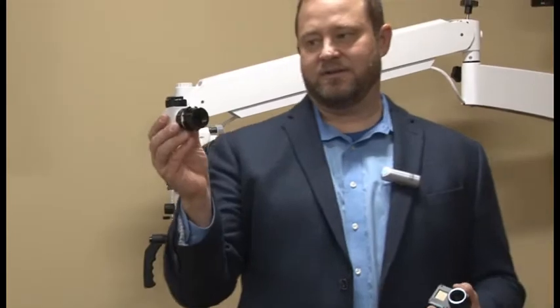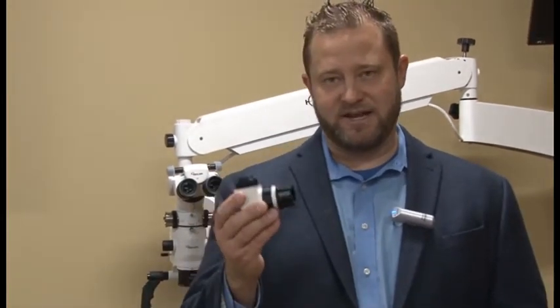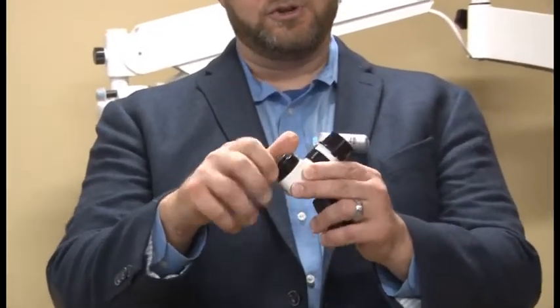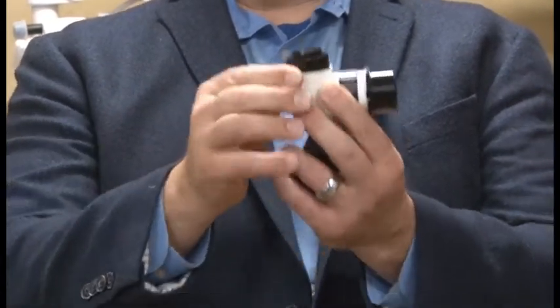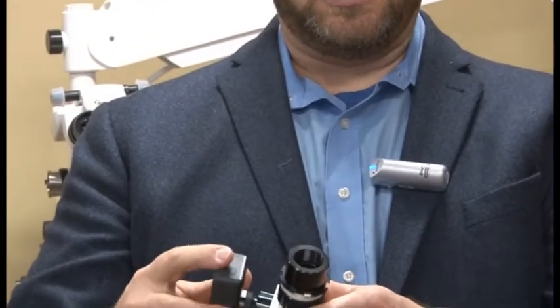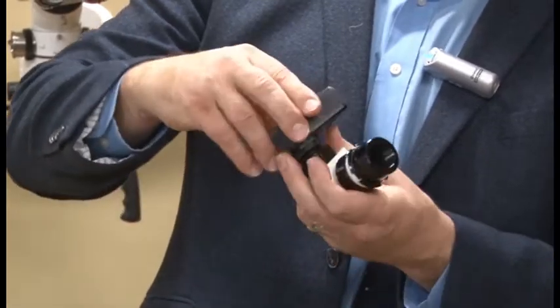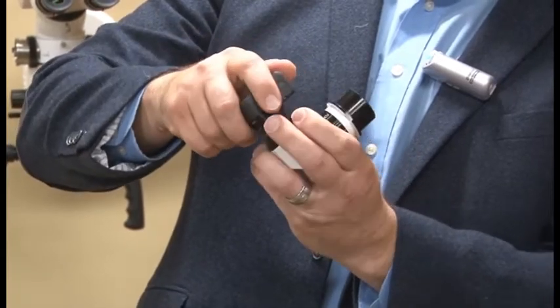Here's our customized C-mount adapter for the GoPro. One thing I want to definitely point out is on the adapter, it should not have any additional ring. You should have just this locking portion right here. The only ring should be on the GoPro itself. So what I do, I attach the GoPro to the C-mount adapter, and when you do this, you just thread it on like any other camera.